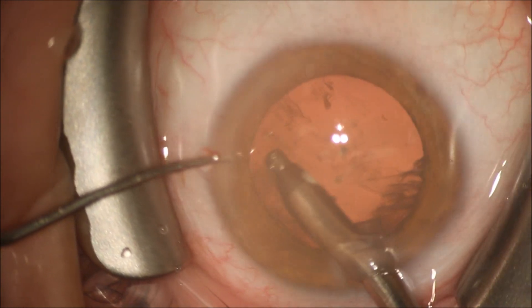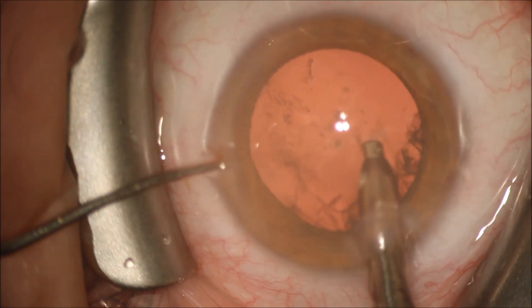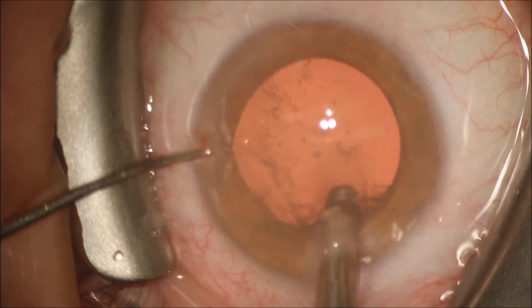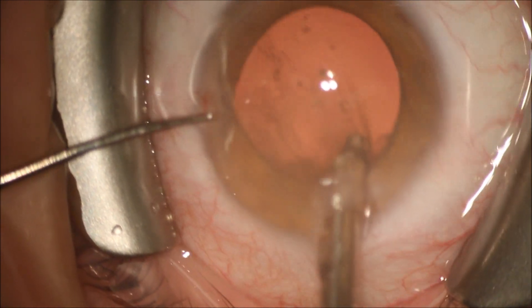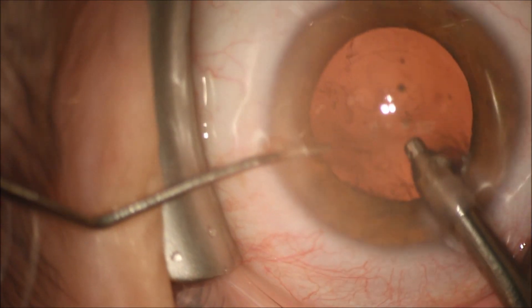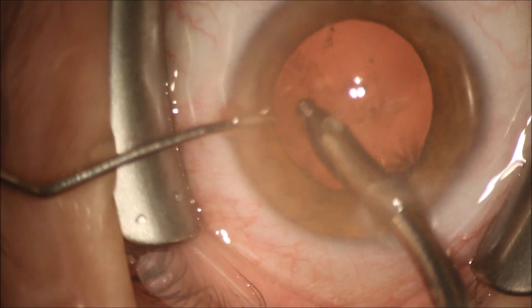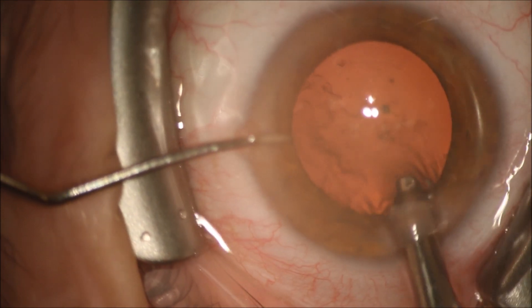Some of the pieces of the posterior subcapsular cataract are more firmly adherent to the capsule. We'll use a cannula with balanced salt solution on a 3cc syringe to remove these using a power washing method that I've found to be very atraumatic for the capsule and safe.